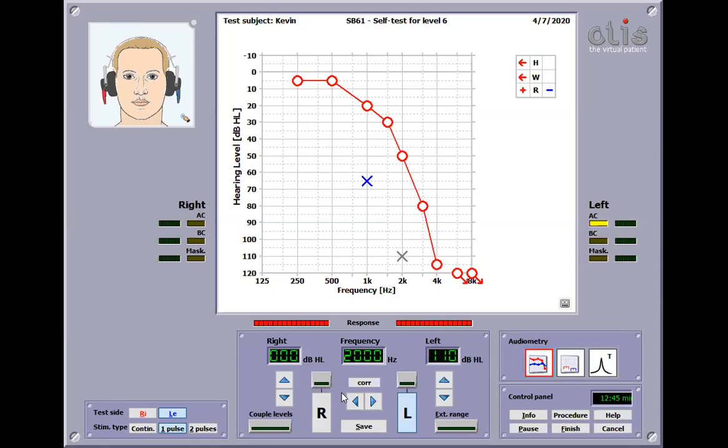It's nothing. I just go oof. Okay, our first ascending is 95 dB. Yep, that was our second ascending. Because there's more than a 20 dB gap, we have to test 1.5K. I'll start with 90.